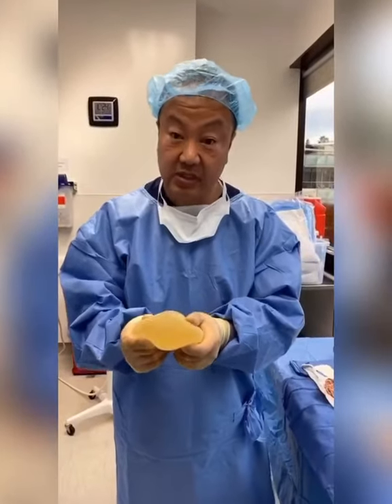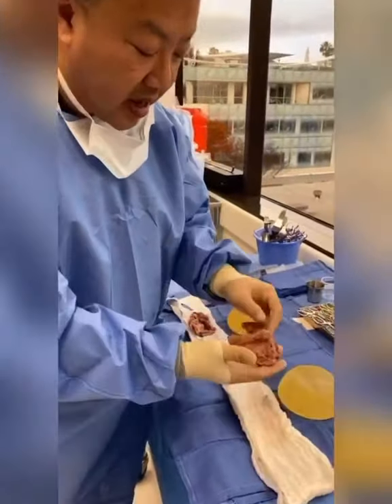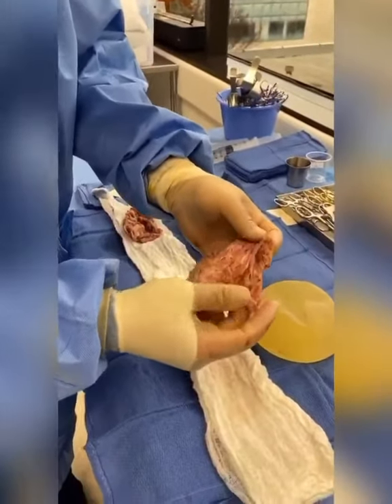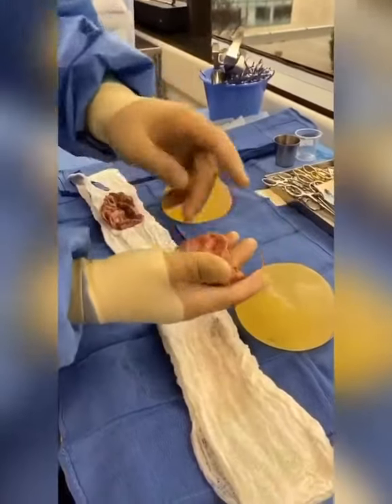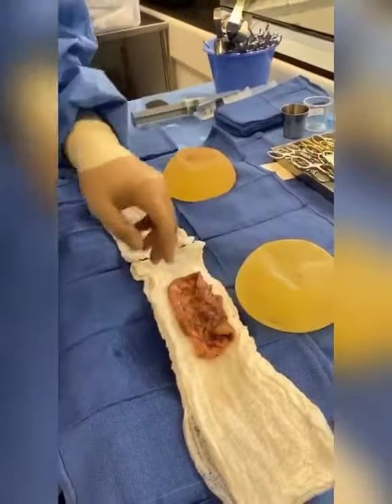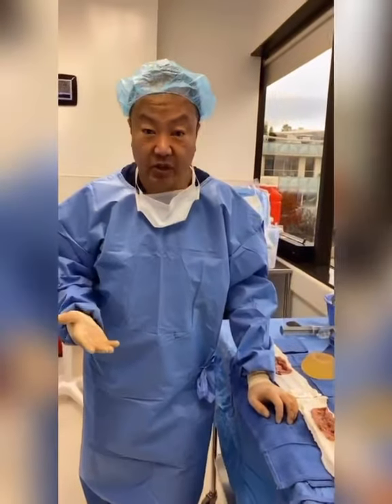When you're removing these implants, it's also very important to go ahead and remove the capsule or the envelope of tissue that surrounds the implants, and we remove this en bloc — in other words, in one complete piece. Of course you can see that there are little nicks here and there from me taking it out, but this is sent to pathology as well as the implant, in order to make sure that there are no abnormal cells and therefore make sure that it is completely healthy.